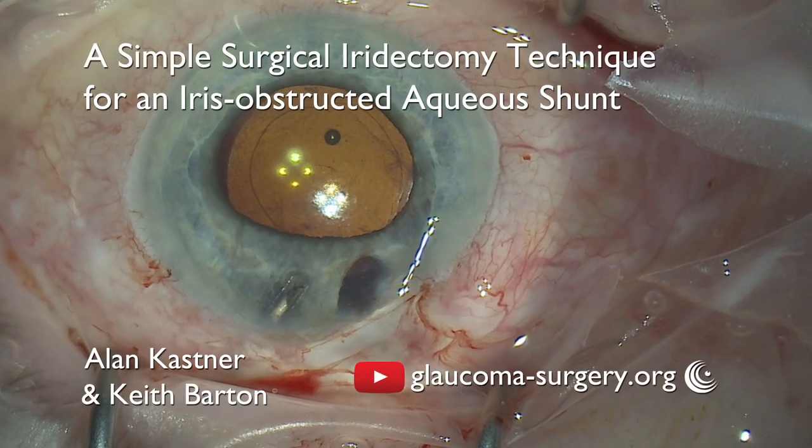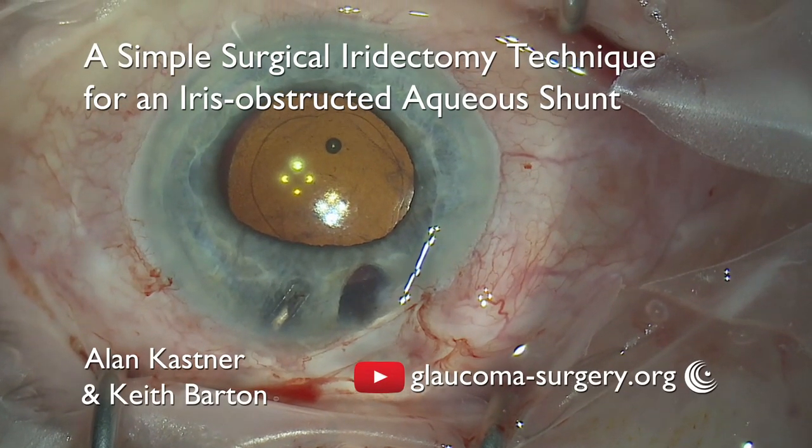Hi, I'm Keith Barton and in this short video Alan Kastner and I will describe a very simple technique for the relief of an iris obstructed aqueous shunt.